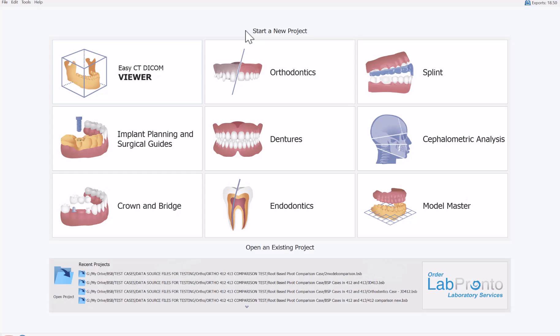We have two new significant updates in our surgical guide wizard process flow. In this training tutorial I'm going to take you through the wizard process flow for implant planning and surgical guide design and fabrication for one or two implant cases. This is using version 4.13 of the Blue Sky Plan software. If you're not using version 4.13, please upgrade to the latest release. I'm going to start the process by clicking on Implant Planning and Surgical Guides.